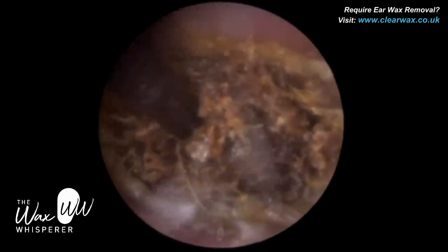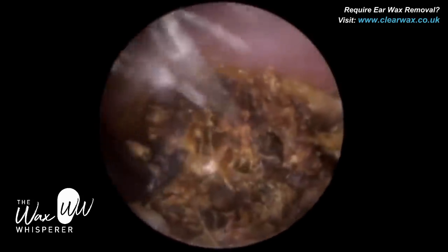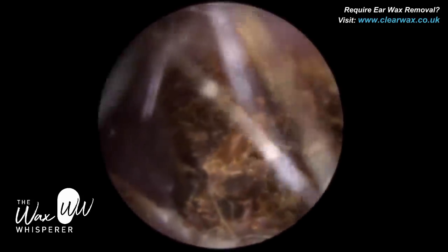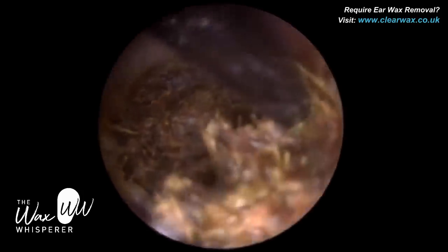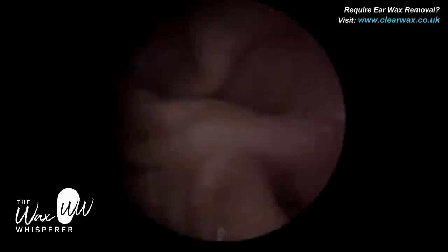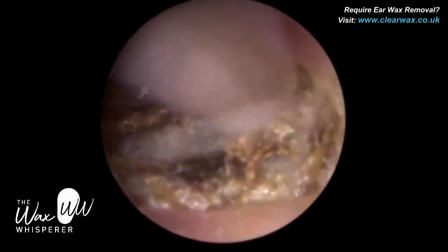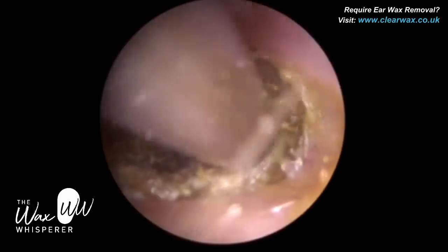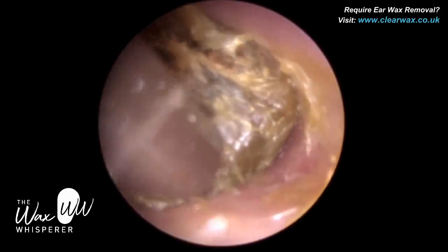What I've done now is informed the patient, pre-empted them, and conceded that I'm just going to have to get this out with the earhook. I'm not going to put any more drops in because the patient has already used a massive amount of drops. And as I said, when the core is this hard, drops aren't really going to do much. They may soften the edge and lubricate it to facilitate extracting it forwards a bit, but it's just too large and too deep.